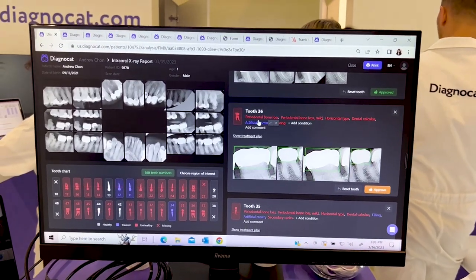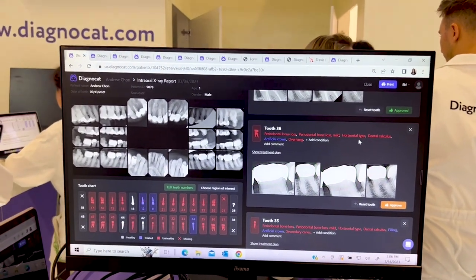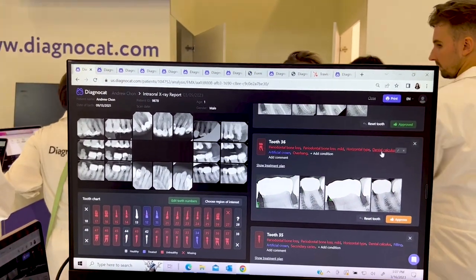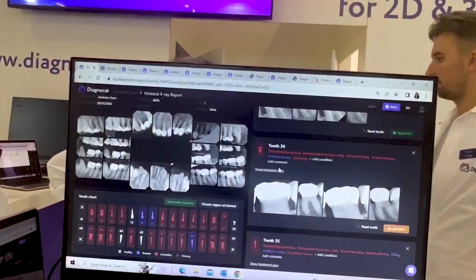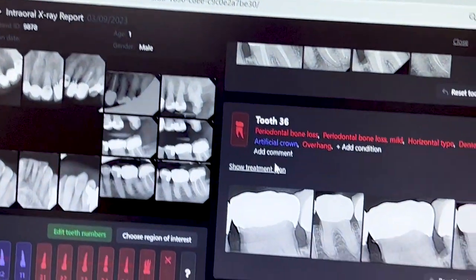You got periodontal bone loss, you have dental calculus — it'll show many different conditions in the mouth.